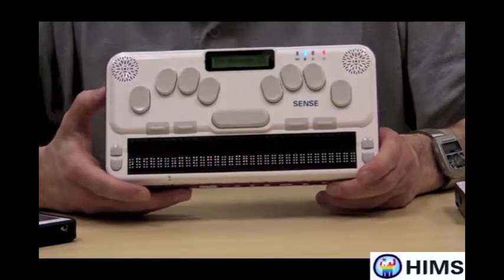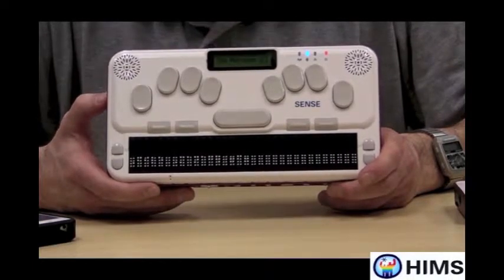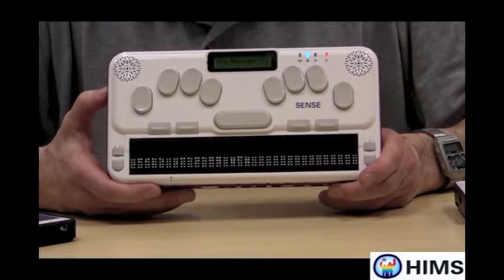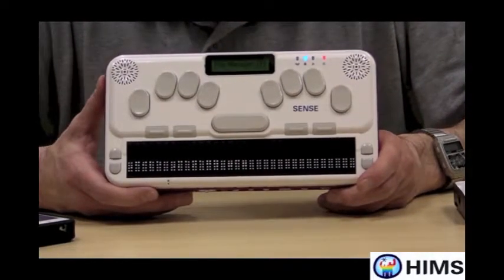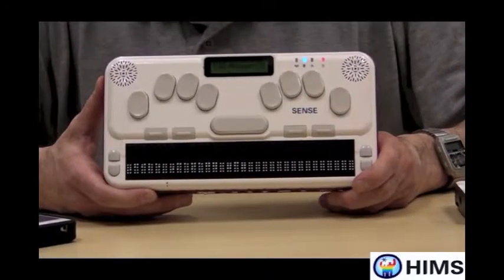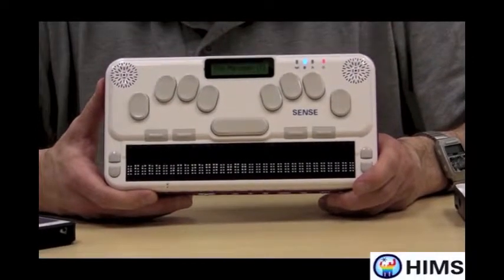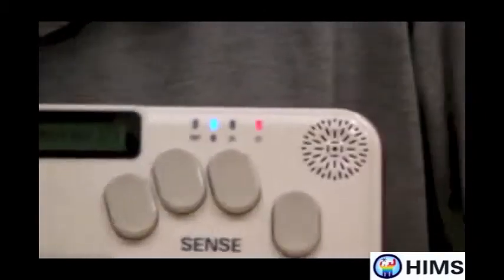The BrailleSense U2 even has built-in Bookshare capabilities, meaning that I can use the unit to go to Bookshare, find a book, download it, unpack it, all in one or two keystrokes. It even has Google Maps on it, so if I'm on a Wi-Fi network, I can start Google Maps, put a route together, and even take that route offline to use when I travel.